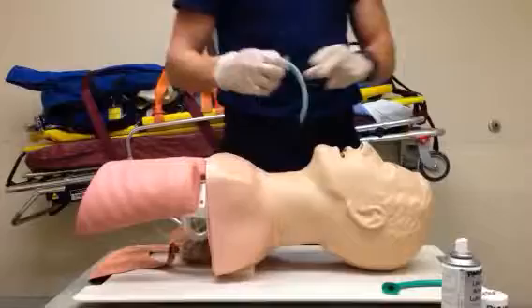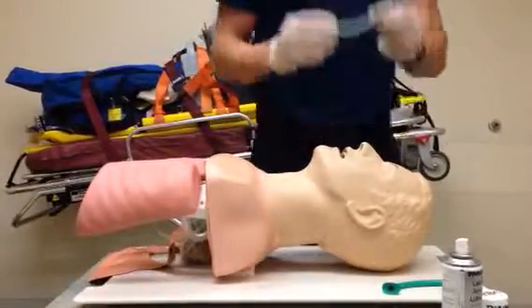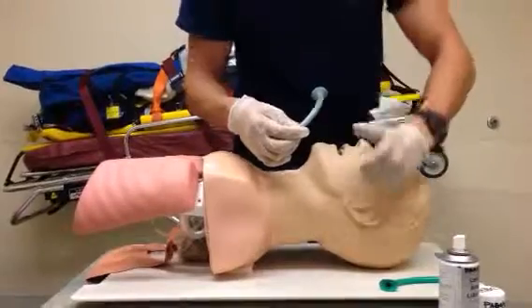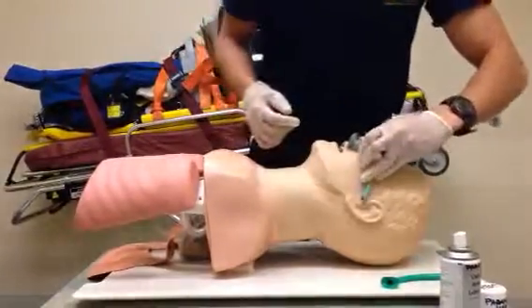Alright, I'll explain this step by step. First thing you want to do is size the proper NPA. You want to size it from the nares to the tragus. You can see here that's the correct size.